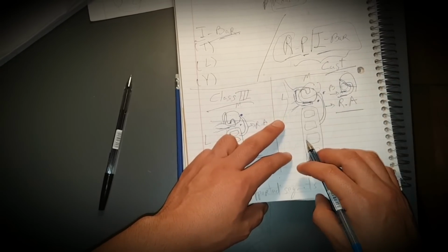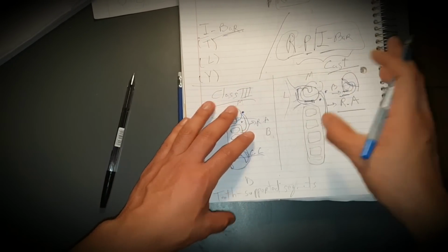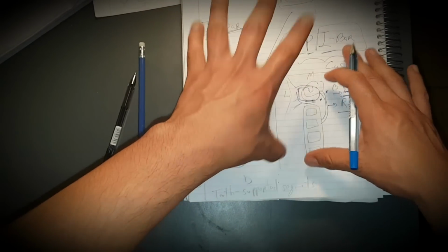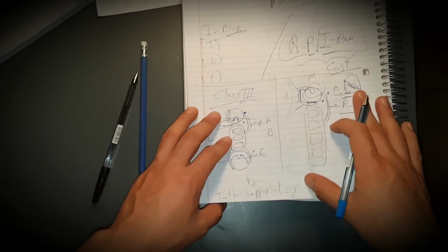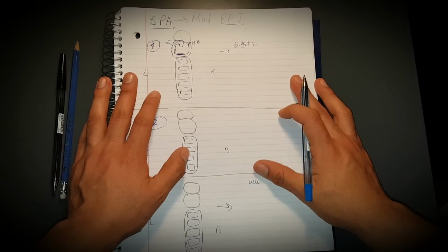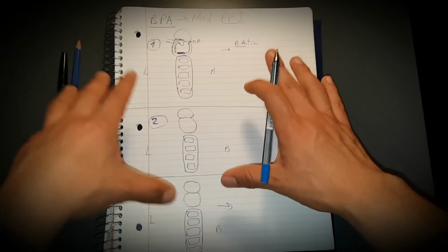Okay, so that's when we use an RPI. This is the difference between an RPI and just a regular I bar: just the position of the rest. So with that we covered how to draw all the clasps. Guys, before moving on, I would like to explain very well how to draw an RPA clasp.